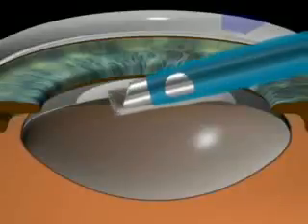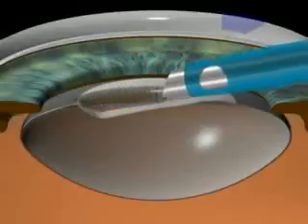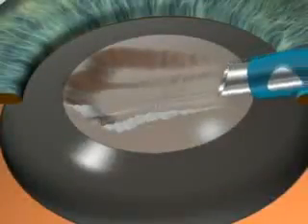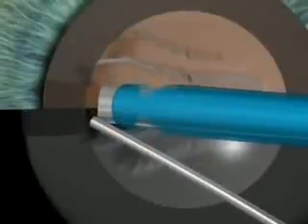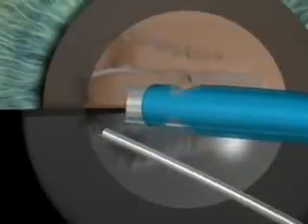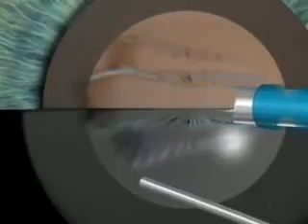Phacoemulsification. A spatula and the phaco tip are inserted through the incisions. The phaco tip starts the down slope sculpting. As down-slope sculpting proceeds, a deep trench is created in the center of the nucleus. The instrument tips move deep into the trench, and the lens is cracked. The cracked lens is then rotated and cracked again until 4 quadrants are left.